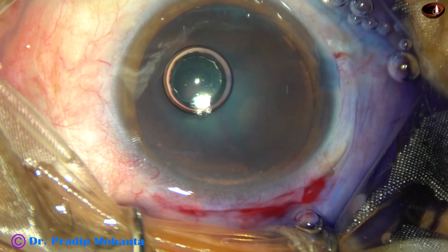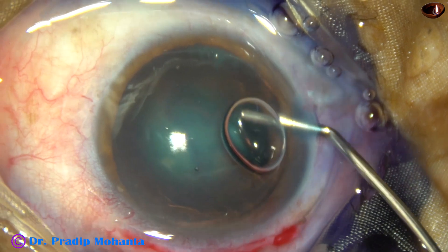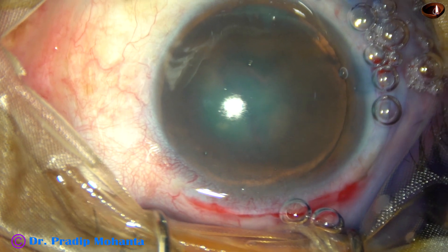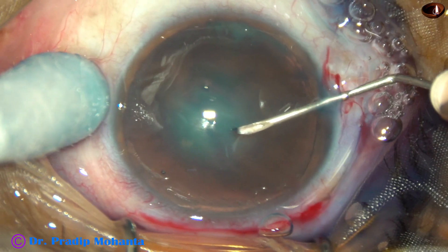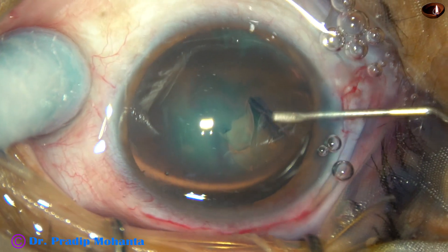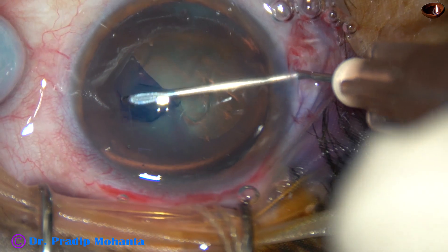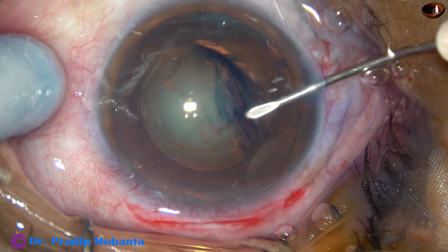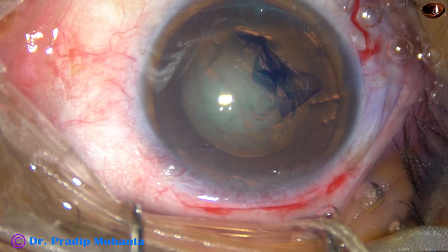The dye is washed out. Then 2% hydroxypropyl methylcellulose is injected into the anterior chamber. The air bubble should be removed. Many colleagues don't use an air bubble and that is okay. Now see how to make a rhexis with this needle cystotome. I made a flap — flip the flap — and now guide this flap all around. Let us see if we can do a round rhexis with this needle itself. It is very much possible. You just have to bring some control in the delicate muscles of your hands.